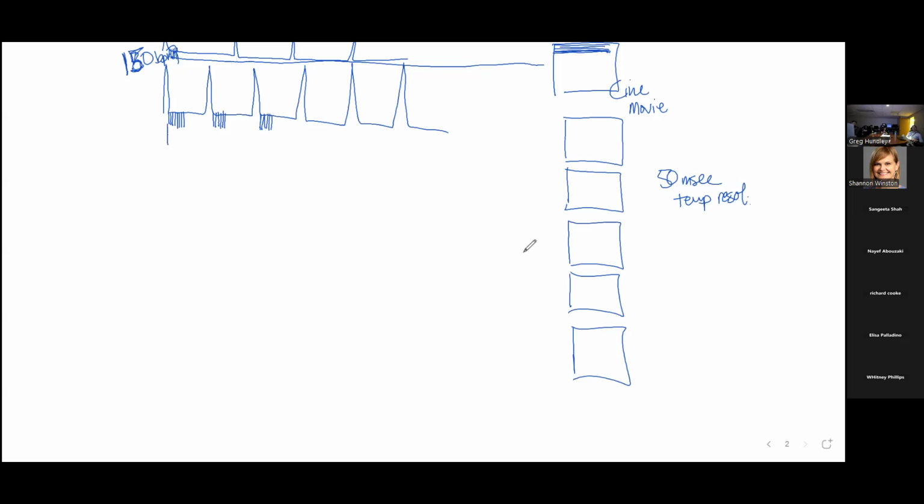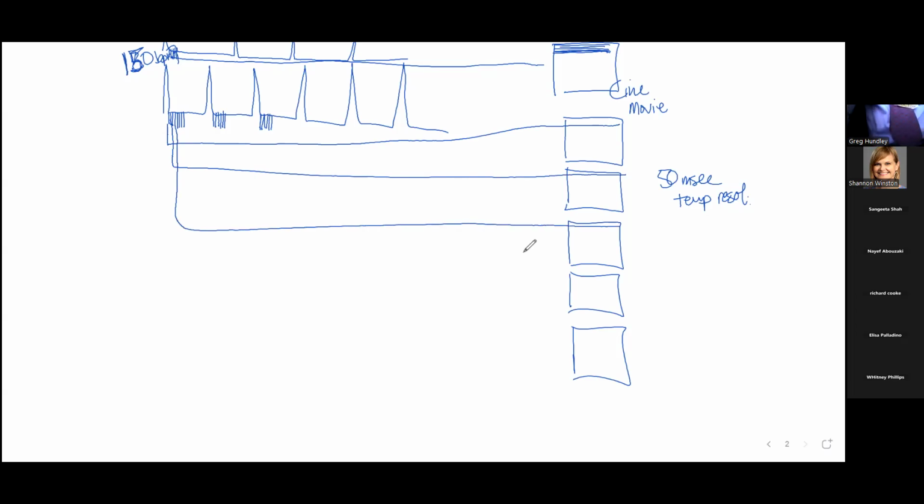But you come over here, we've got to fill up, remember, the first point in time, second point in time, third point in time. You take advantage of that fast heart rate. So whereas here at 60 beats per minute, let's do this again.